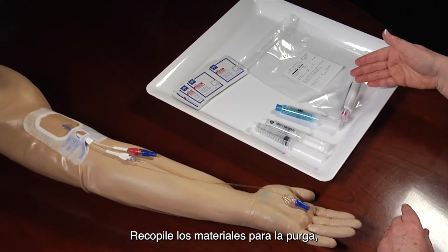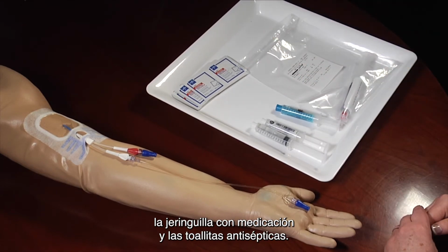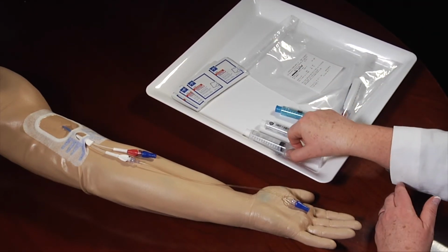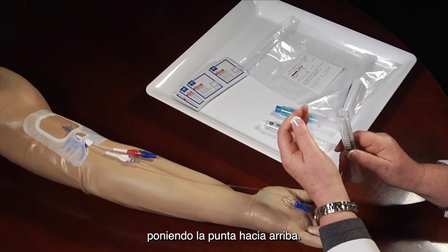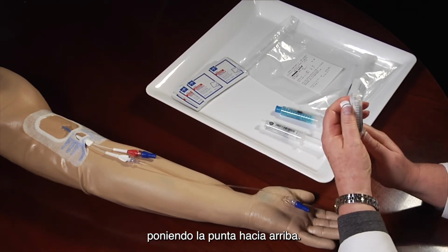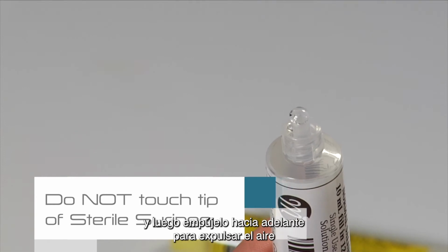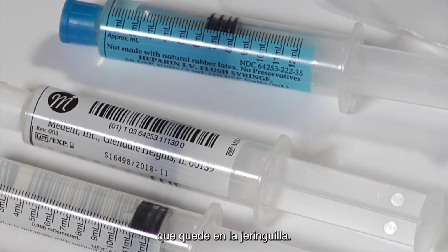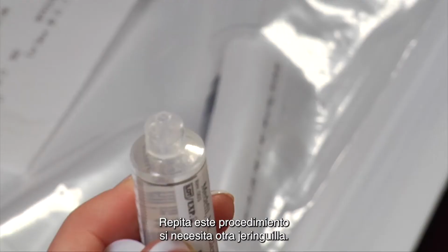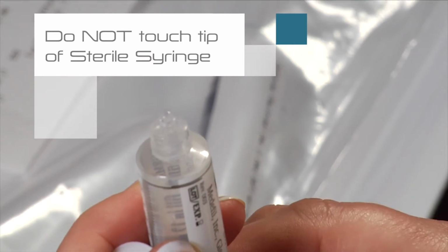Gather your flushing supplies, syringe of medication, and antiseptic wipes as directed. Prepare all pre-filled syringes by holding them with the tip in an upright position. Gently pull back on the plunger, then push gently forward on the plunger to expel any air that is in the syringe. Repeat this same procedure with every syringe as needed.